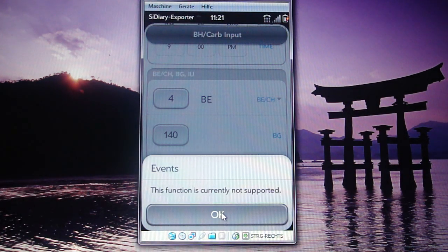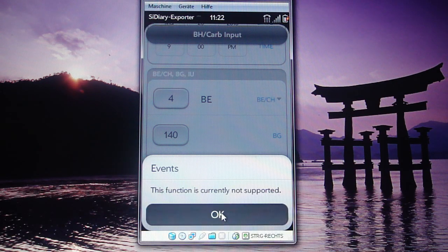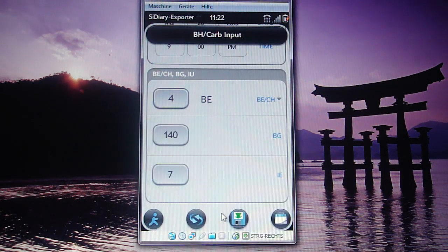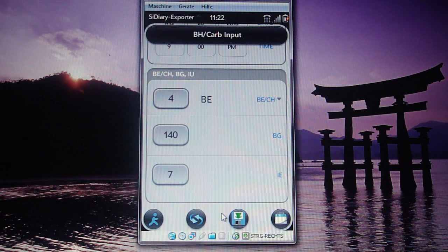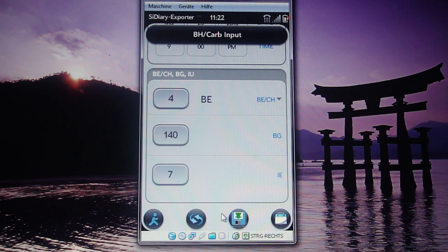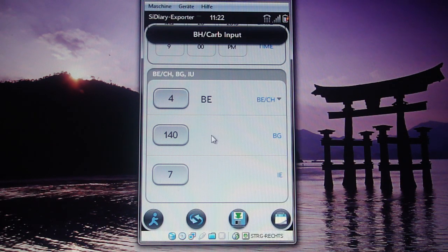The next button is currently not supported in this version but will be a function in the next version. It will enable you to enter events like sport, when you wake up, when you go to bed, when you have a hypo, and all that — and it will be saved in the tool too.